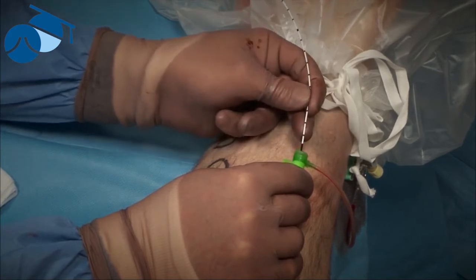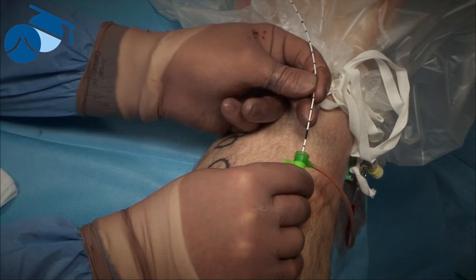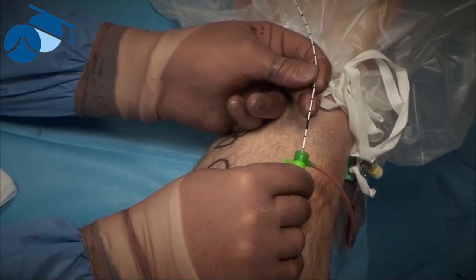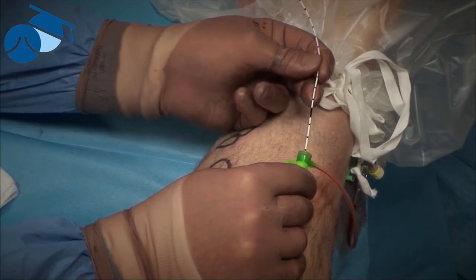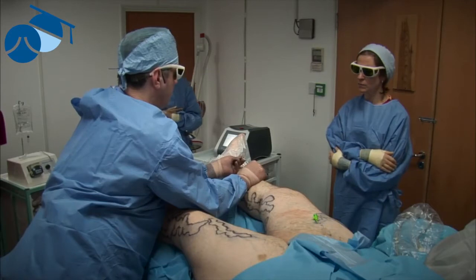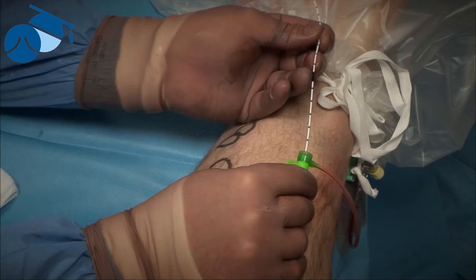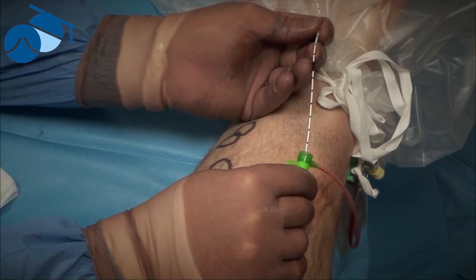If you know when the end of your fibre is going to appear on one sort of cannula, and then suddenly without telling you, your hospital or staff suddenly change cannulas, you might get into trouble, because you might end up either burning the end of the cannula if it's longer than you were thinking, or you might end up burning the skin if it was shorter than you were thinking. So it's very important to always use the same equipment, and if you change equipment, to spend some time looking at it outside of the body, so you know exactly where the end of the laser fibre is in conjunction with the end of your cannula when you're doing the pullback and you get near the end. It sounds simple, but it's amazing how many people do get into trouble when there's a sudden change, even if they're very experienced.